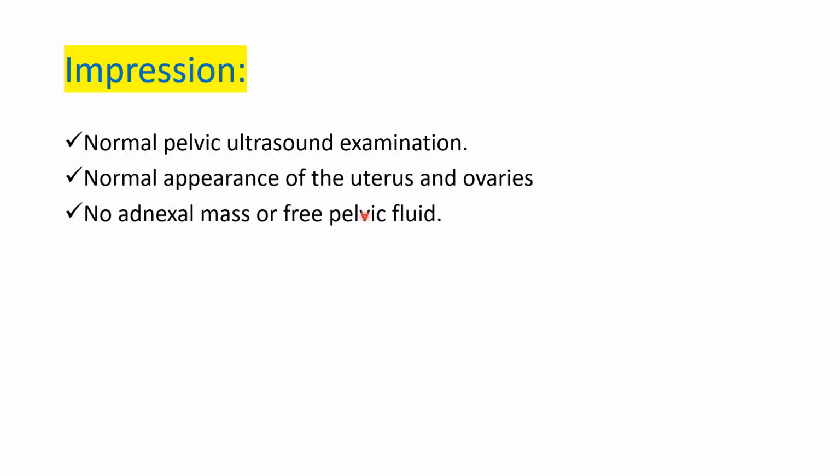So to those of you who are still learning, I need you to write this report down so that you have a sample for your future use.